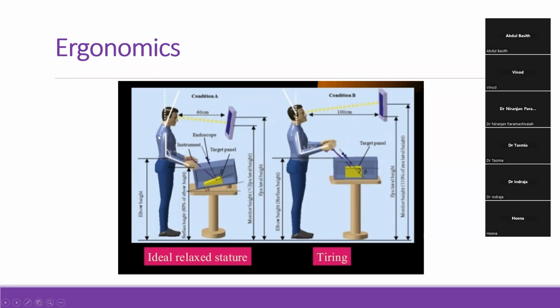It should be nice and flat. And the monitor must be at the level of your eye, or perhaps a little lower. You will find that in most of our arrangements as we work even today, the monitor is at a higher level because that's the height of the stack that you have, and that is not an ideal arrangement. All right, and the head should be either straight on or slightly flexed.